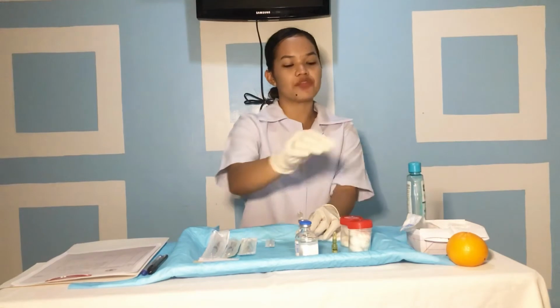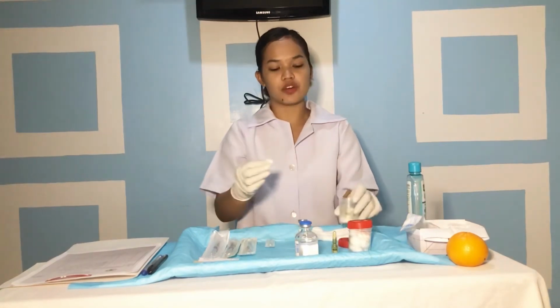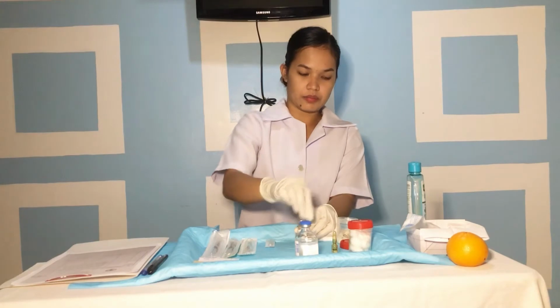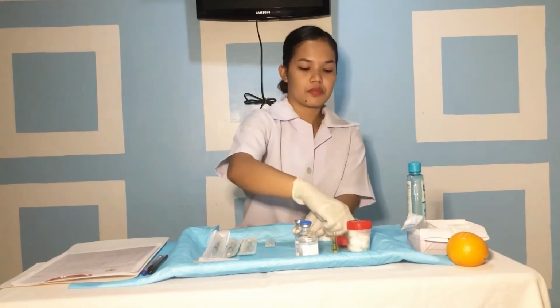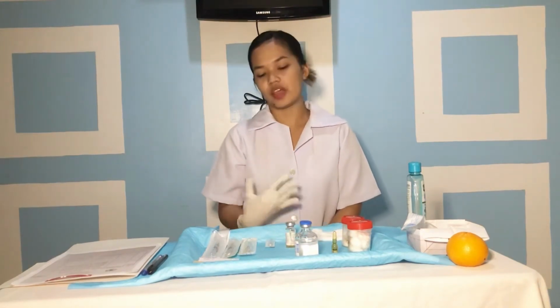So we firmly and briskly wipe the surface of the rubber seal with an alcohol swab and allow it to dry. Allowing the alcohol to dry prevents the needle from being coated with alcohol mixing with medication.